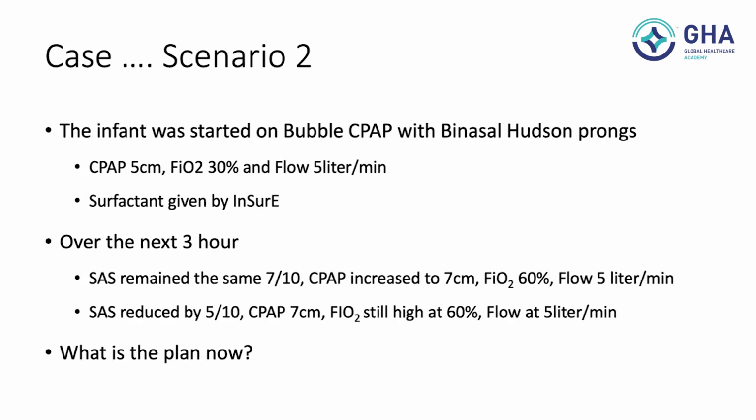And if the bubbles are reaching the lungs, you will be able to hear the bubble sound. Also look for humidification. On the humidifier, you should see a temperature of 37. There should not be any water in the inspiratory limb, and there should be some condensation in the expiratory limb, to say that you're actually giving a temperature of 37 and a relative humidity of 100% to the nose. That means you're giving warm and humidified gases to the nose, and that is what you have to do when you're giving CPAP for all babies. So 50% of CPAP is delivering the gases at 37 with a relative humidity of 100%. The other 50% is delivering the correct pressure to the lungs.